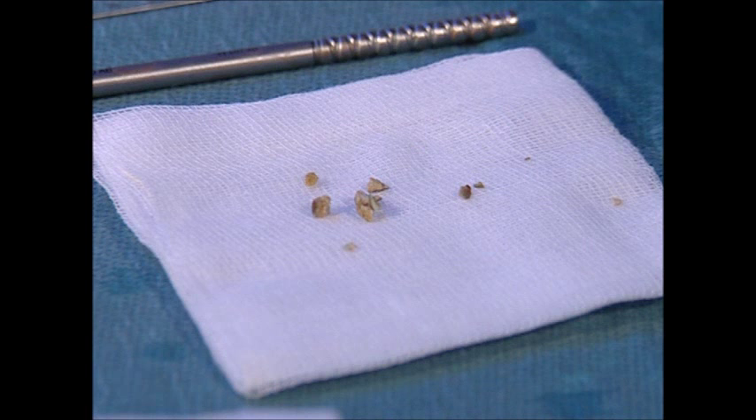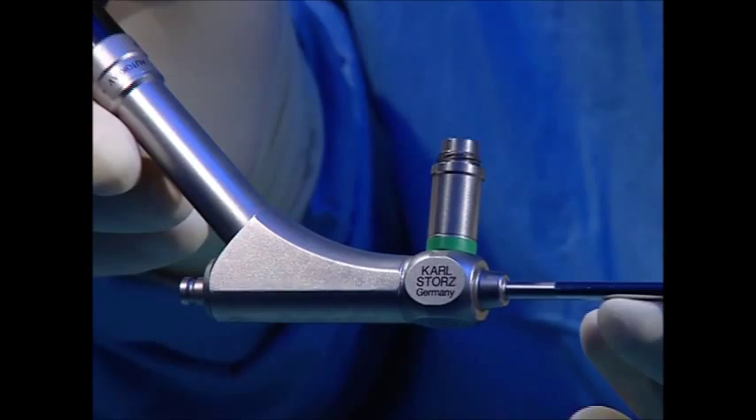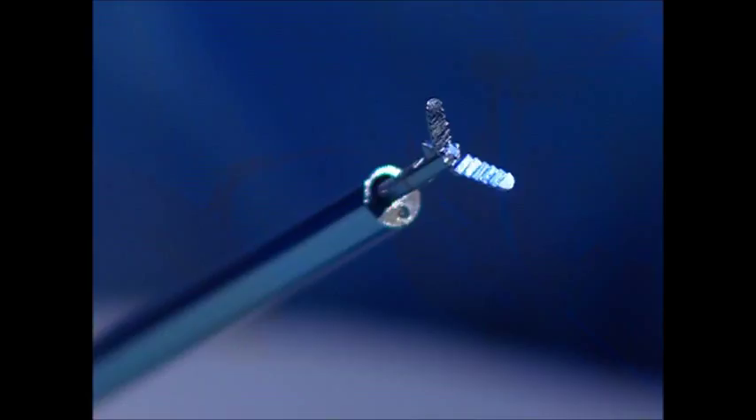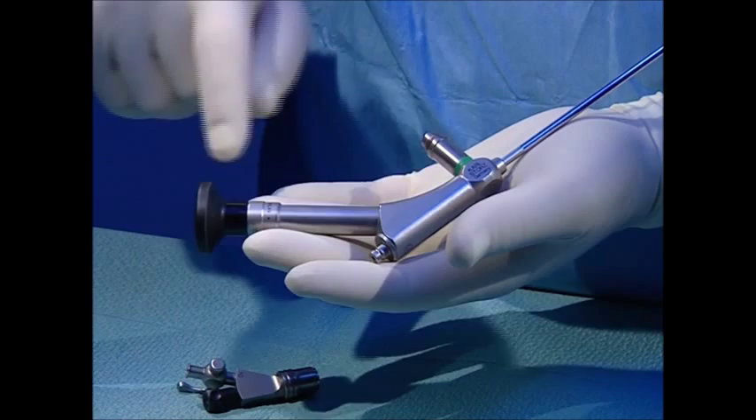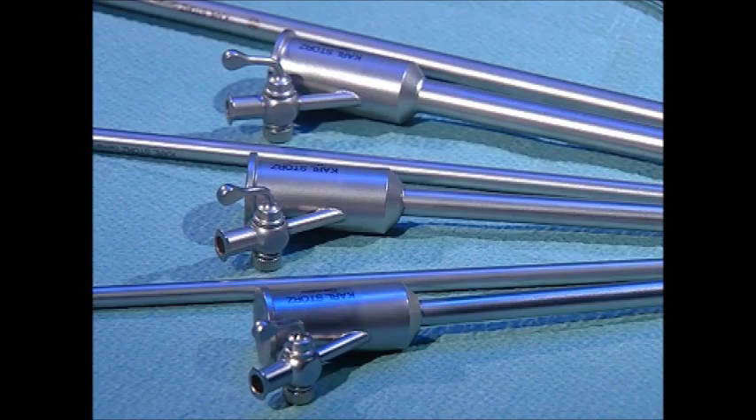The nephroscope with a 12-degree field of view has a reinforced sheath in order to prevent breakage. Rigid instruments and probes up to 5 French can be used. The angled eyepiece allows free access and manipulation. Automatic pressure control is achieved by the special design of the nephroscope and of the two larger sheaths.